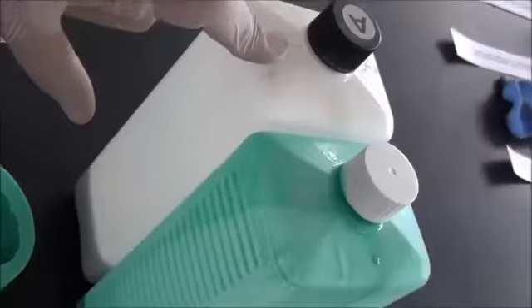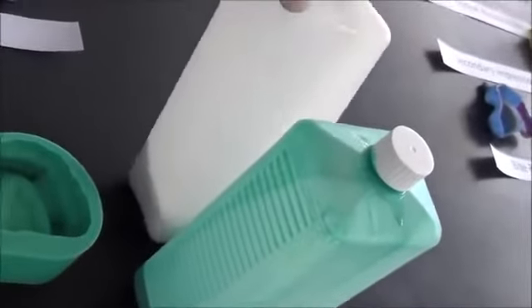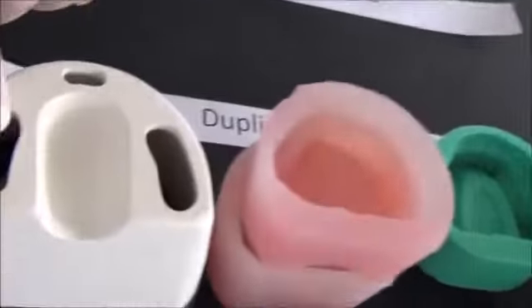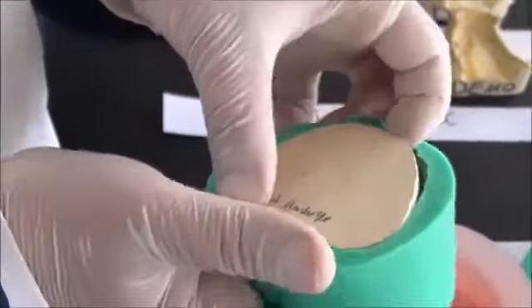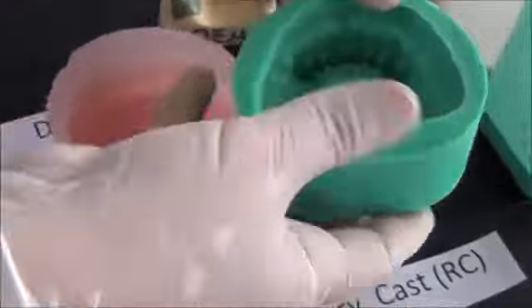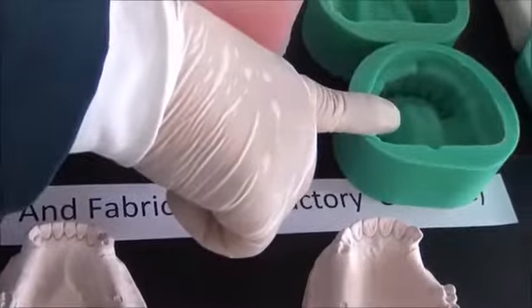Silicon is more accurate. Silicon comes in two containers in a liquid form. The material from these containers is mixed according to the manufacturer's instructions, and once mixed, it is poured inside the flask. Once it's set, we take the cast out, and we will have this empty mold. This empty mold is now ready to be used as a form for pouring in the refractory material.